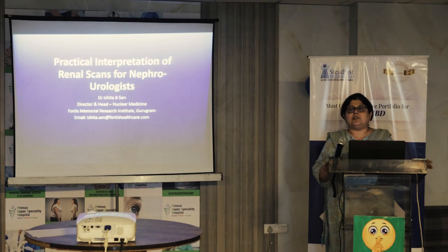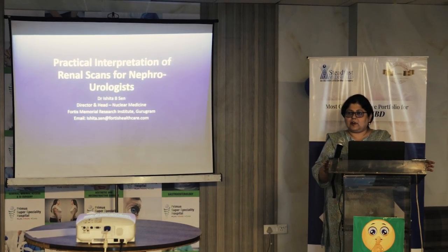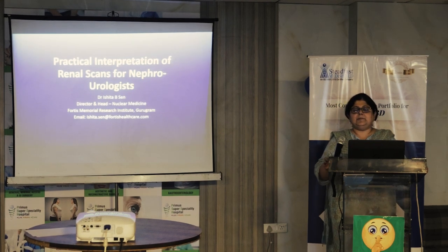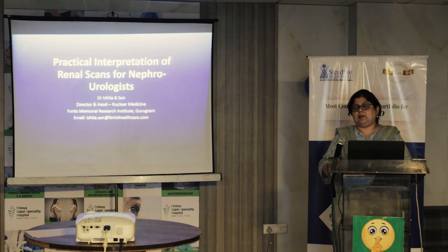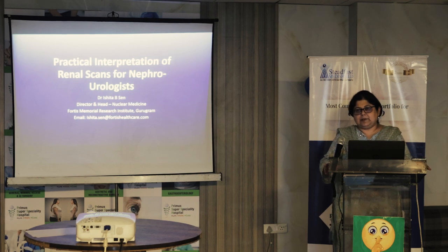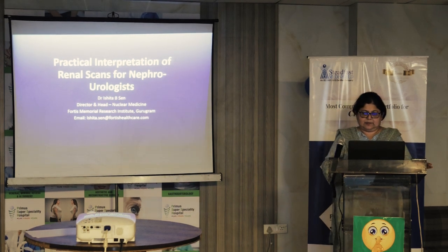It's actually for nephrourologists. I think all of you are training nephrologists, is it? But there's a lot of overlap. So we're just going to quickly go through the basics of renal scintigraphy and the nuclear medicine techniques which are available for the evaluation of the kidney, and then show you some interesting cases. Please feel free to stop me at any point. Let this be an interactive session.